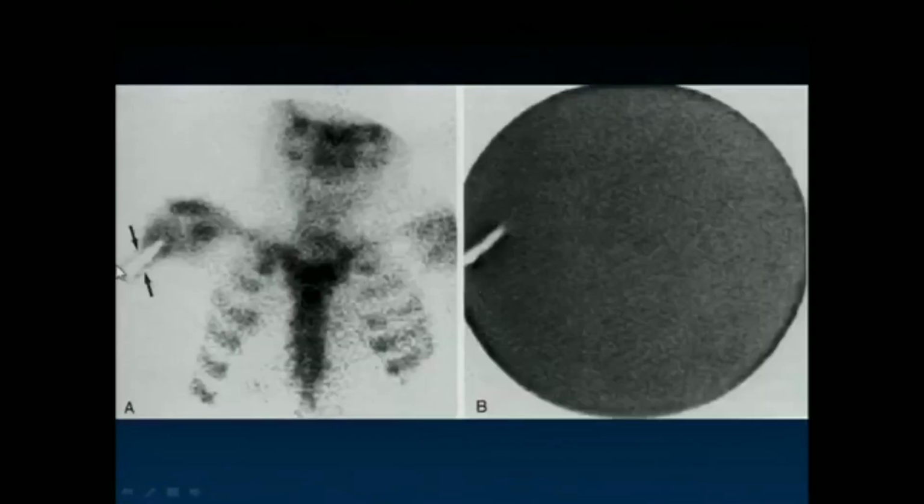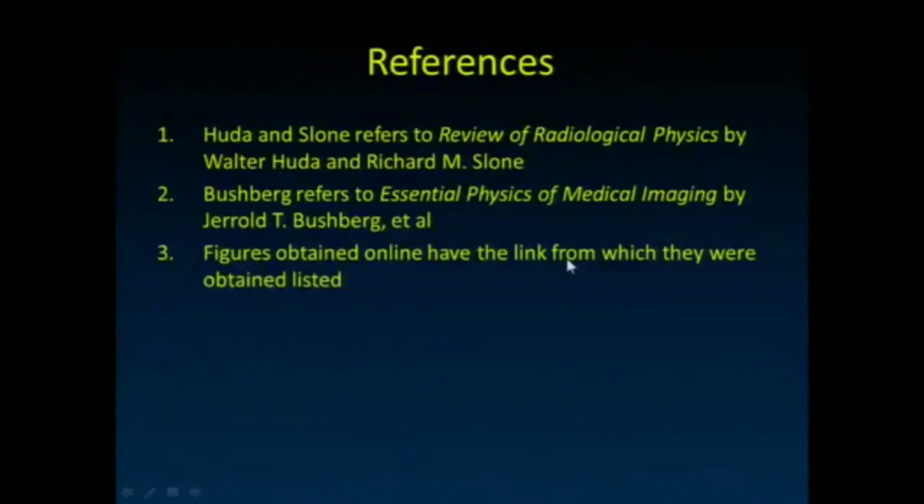Here's a patient with their cross right on their necklace, that metal attenuating there. Here's a nice cracked collimator. You see it as an artifact. You might think the patient has a metallic rod in their femur or something, but you notice when you do the flood there, it still exists, so a cracked collimator.